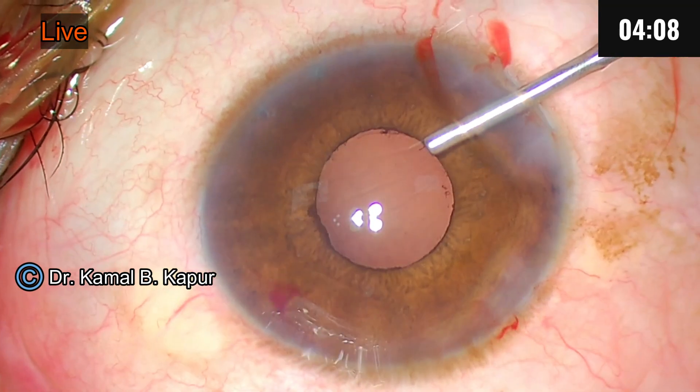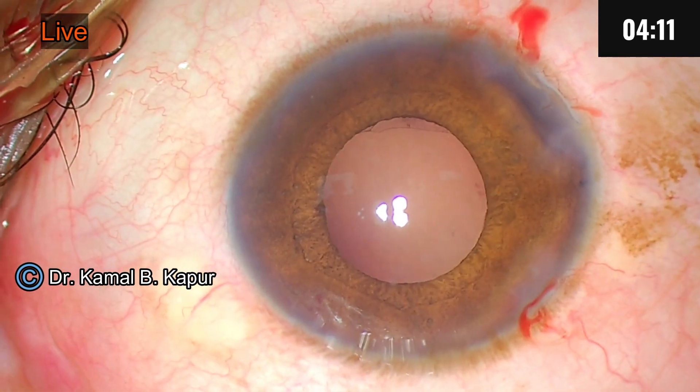Now we will go in and implant the IOL. Surgery is over.